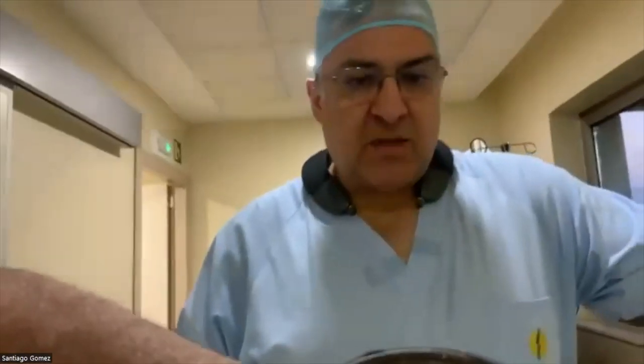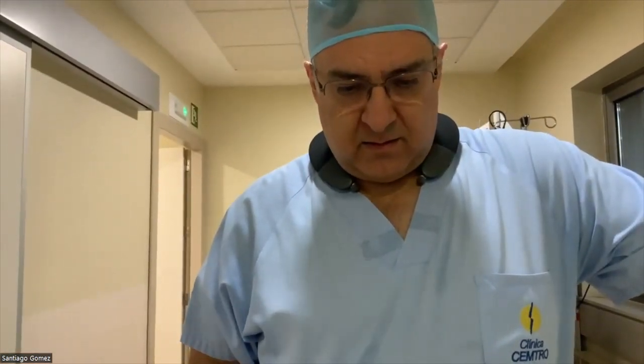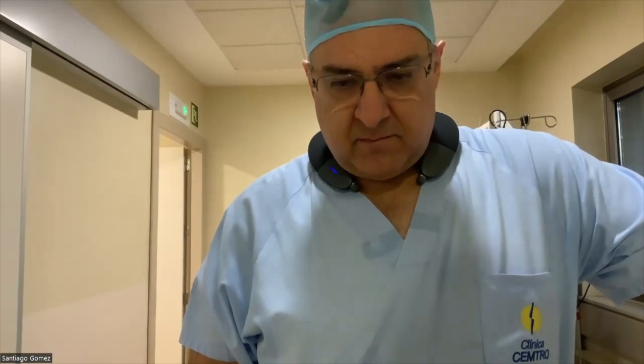But you have experience with that too, Marek. What is your opinion? I think personally that for the very well educated endourologist in HoLEP, using thulium fiber is quite easy, as you mentioned. But for new beginners, it's rather difficult because the bubble is so small that they have difficulty finding the correct plane and they are cutting through tissue. So for the new beginners, probably not so good a laser, in my opinion.